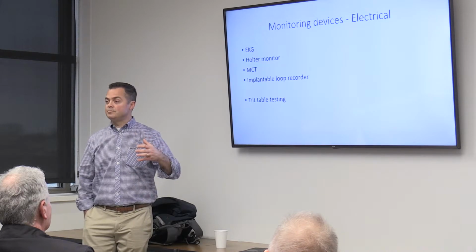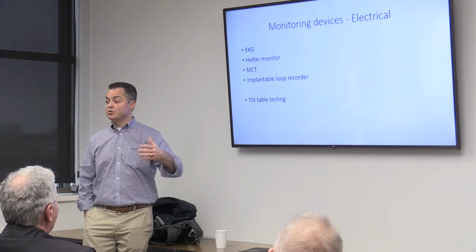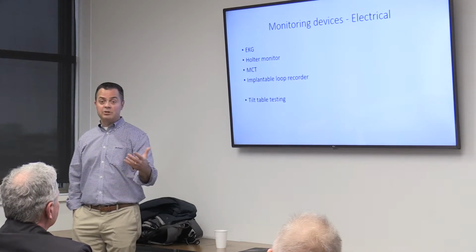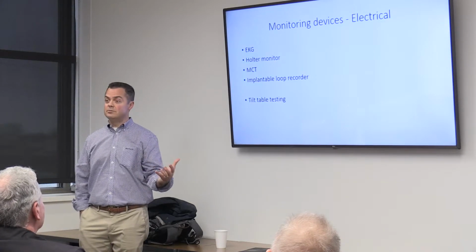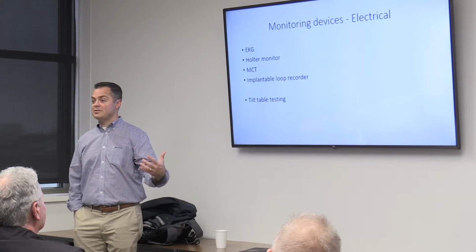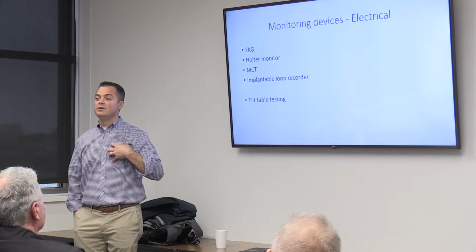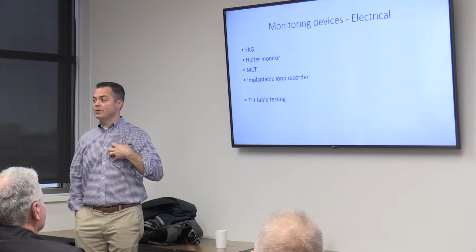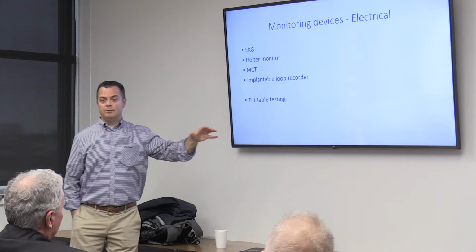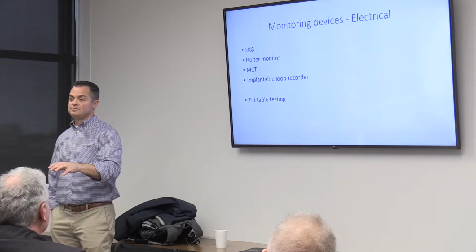But they don't. We program them to monitor for certain arrhythmias, and then you tell us when you feel something. So you can activate it and say, my heart's racing now, or I'm lightheaded, I'm going to pass out. The device will collect your rhythm at that moment and tell us what's happening. So we have to order the right one based on how frequent your symptoms are.